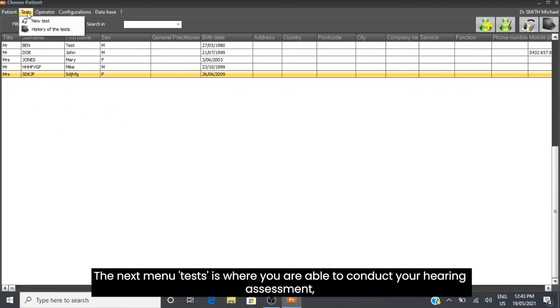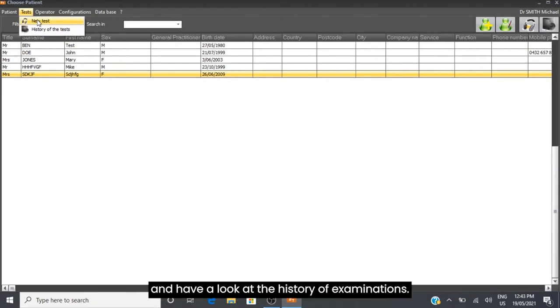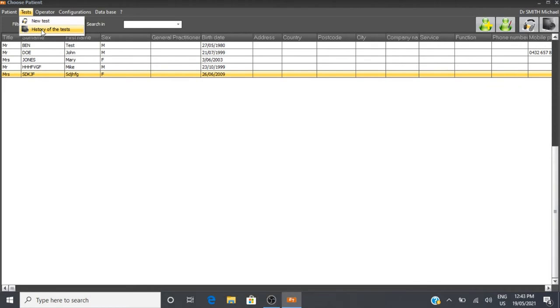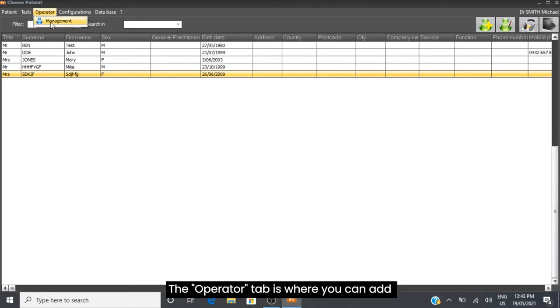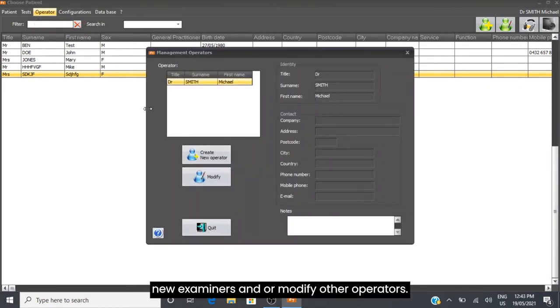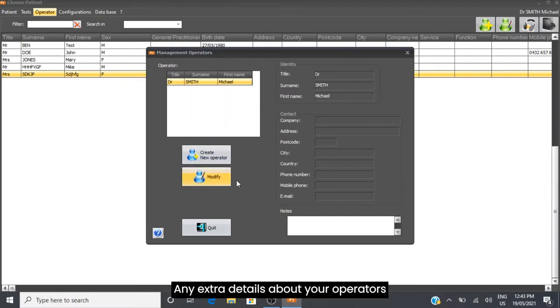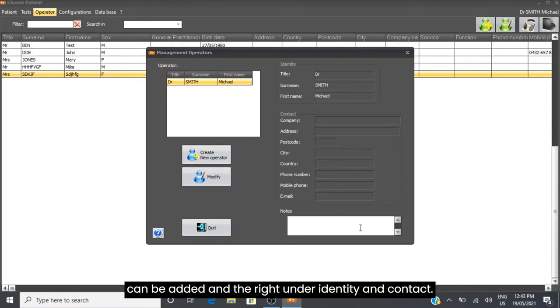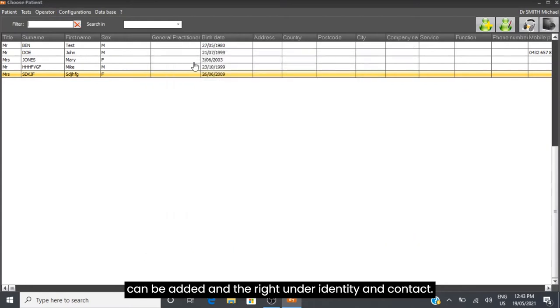The next menu, Tests, is where you can conduct your hearing assessment and view the history of examinations. The Operator tab is where you can add new examiners or modify other operators. Any extra details about your operators can be added on the right under Identity and Contact.